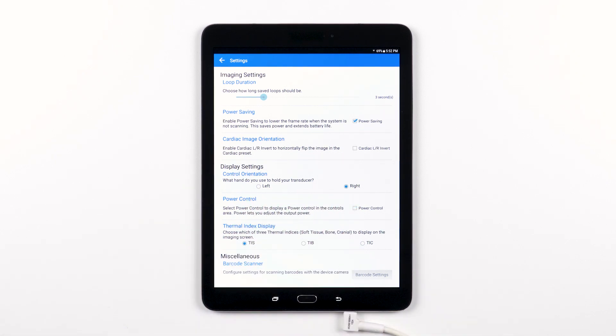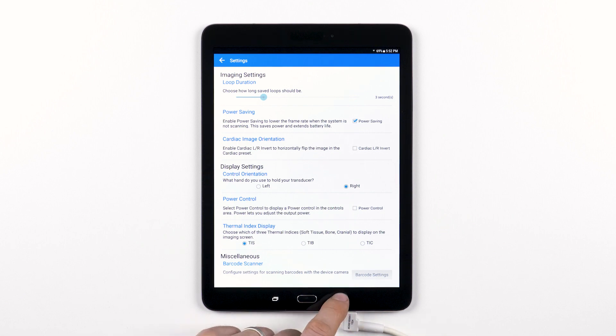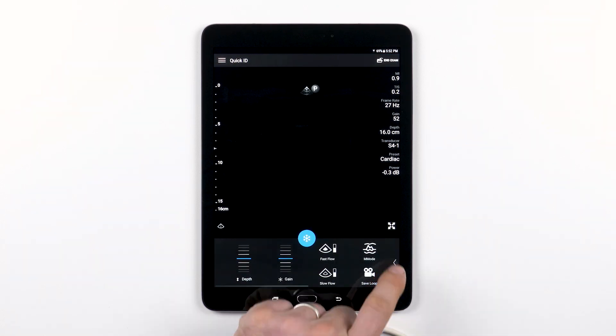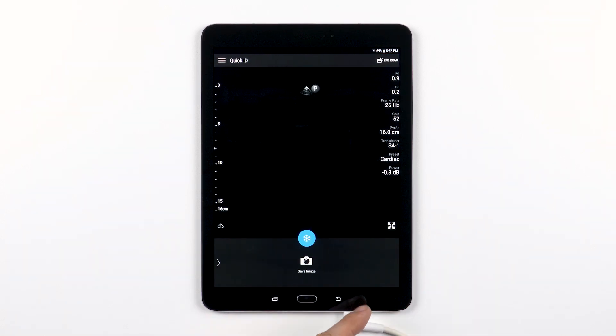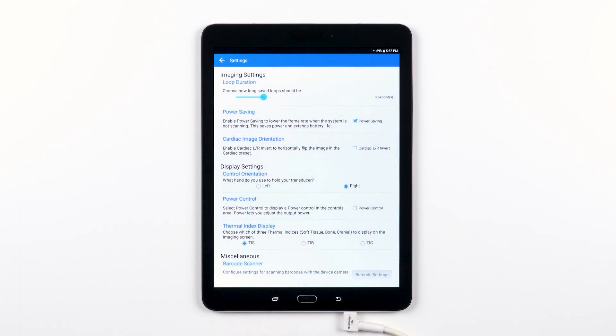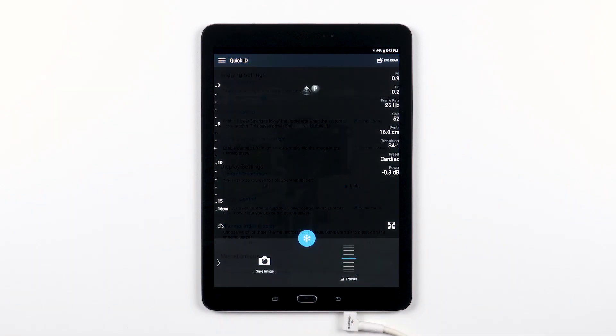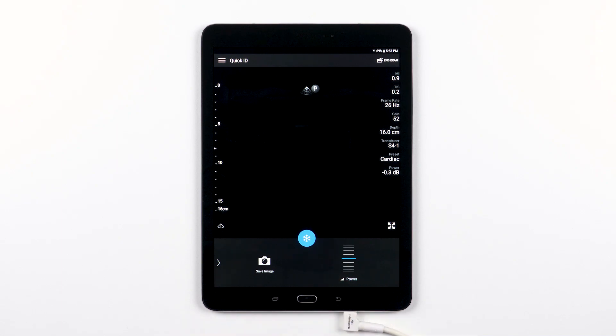The next option, power control, allows you to choose whether or not to have the transmit power control available in the control panel. If you uncheck the box, you will not have the power control available in the main ultrasound control panel while you are scanning.